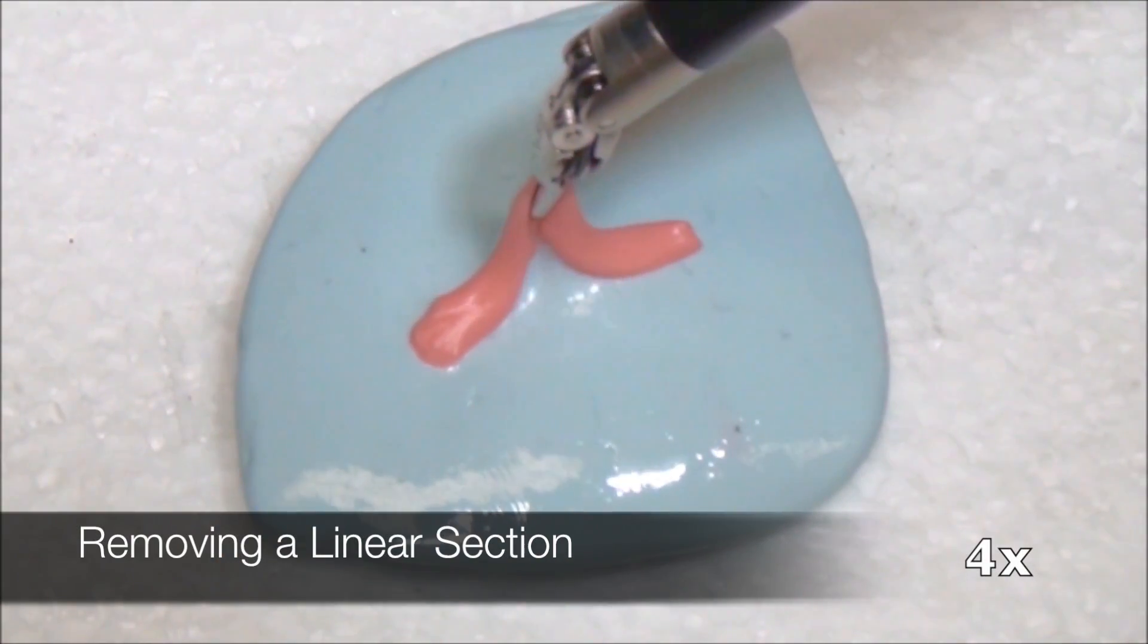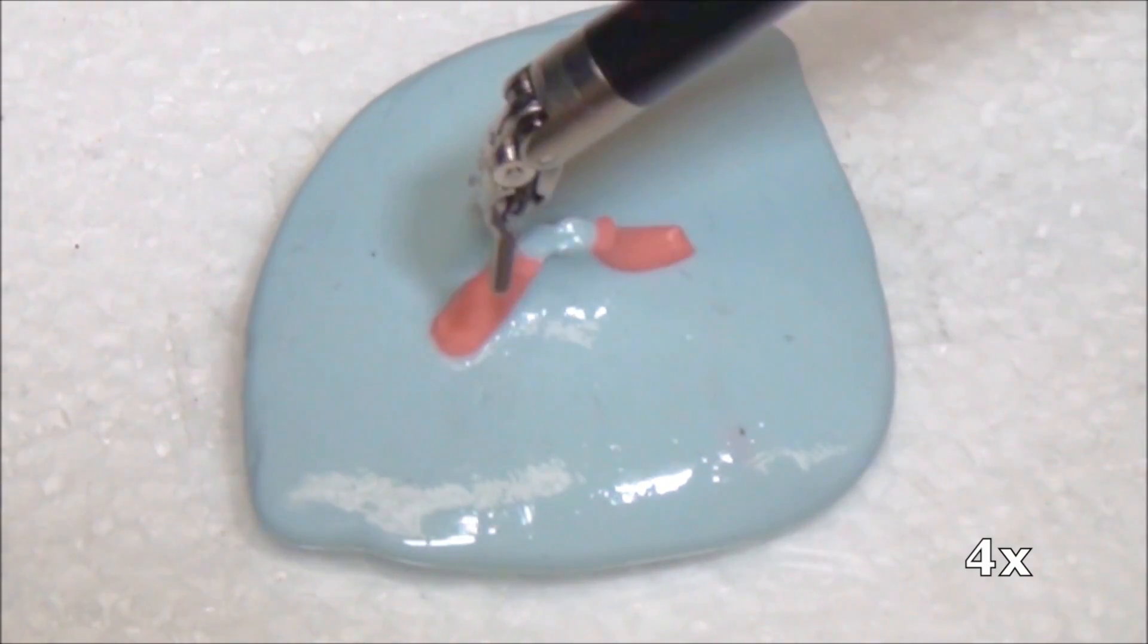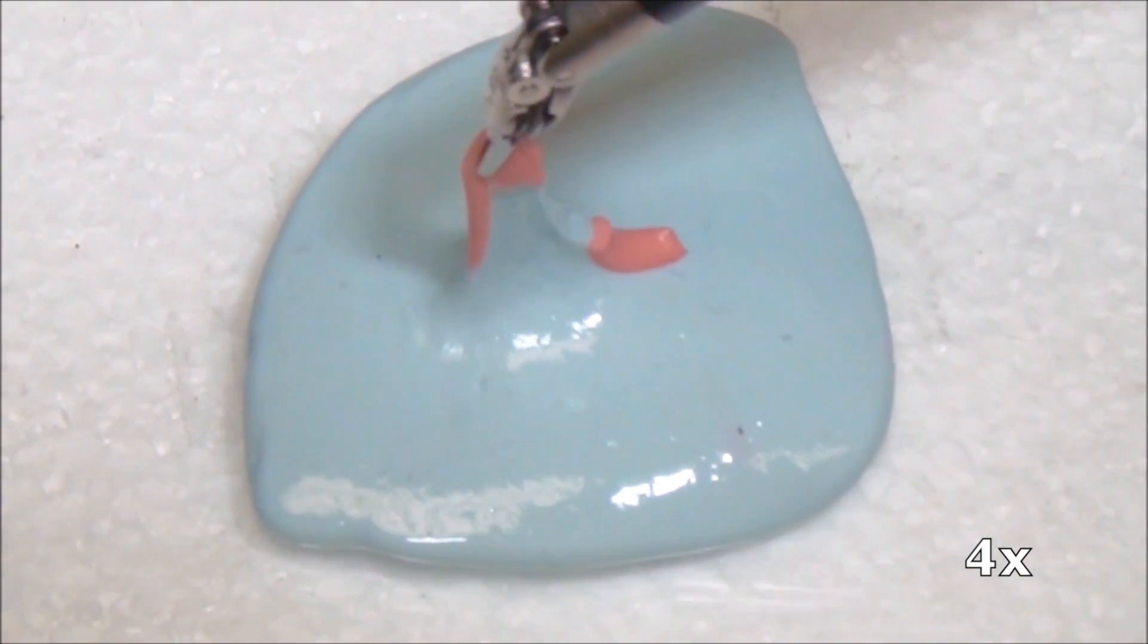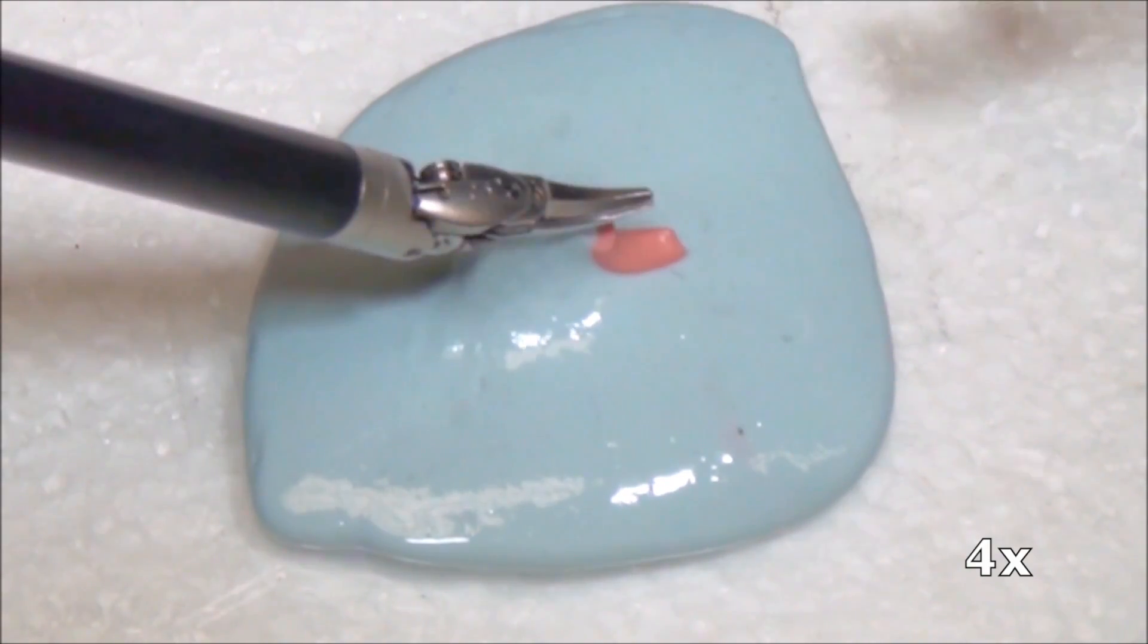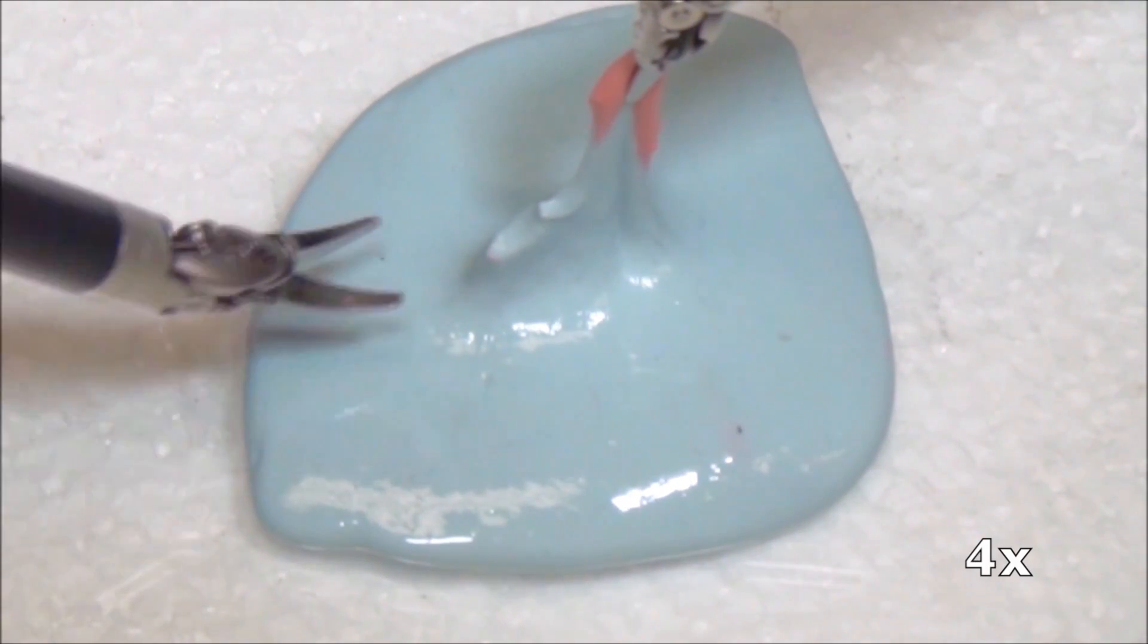The first subtask is linear debridement, removing a linear section of cancerous tissue. We use plastic putty as tissue phantom. A computer vision system identifies the linear section and guides the robot to extract it in subsections. In five trials, the robot successfully extracted all target tissue in pink.